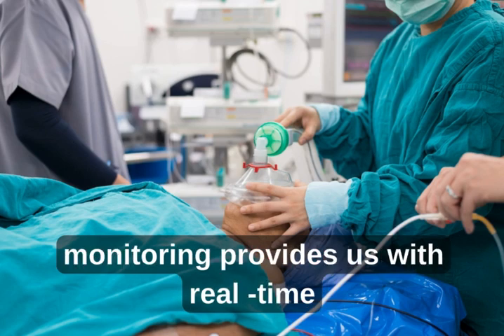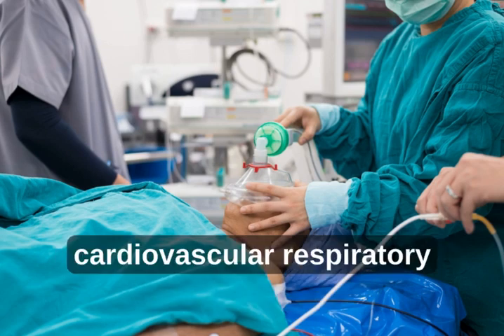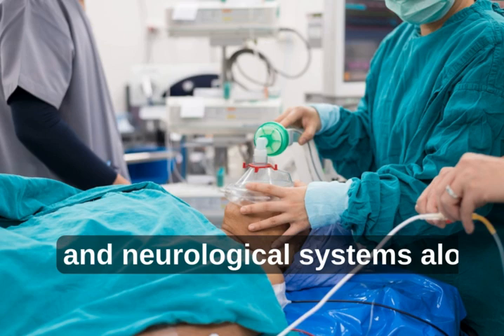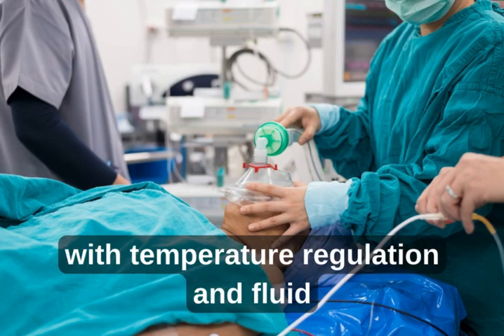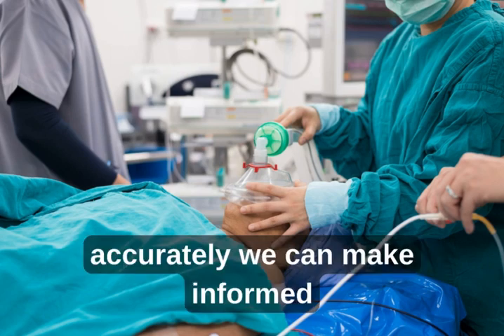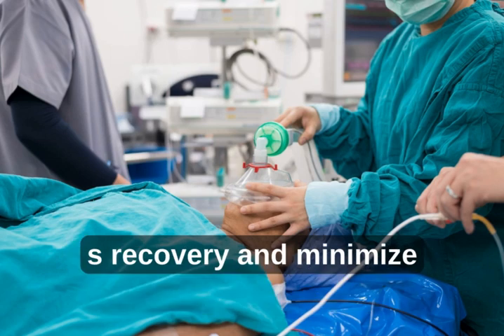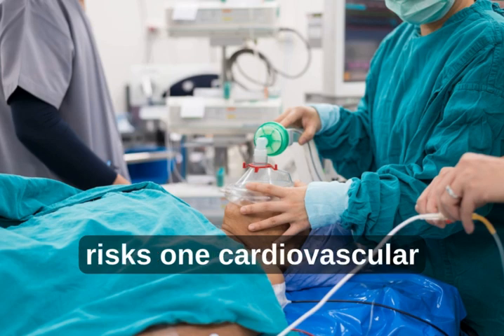Monitoring provides us with real-time data to evaluate the patient's cardiovascular, respiratory, and neurological systems, along with temperature regulation and fluid balance. By interpreting this data accurately, we can make informed decisions that optimize the patient's recovery and minimize risks.